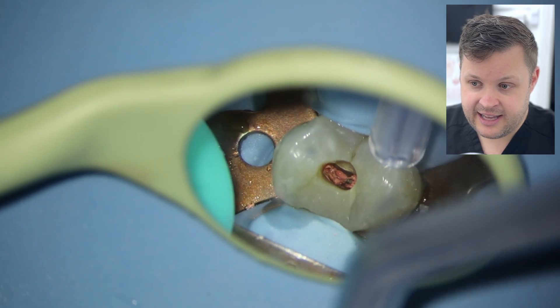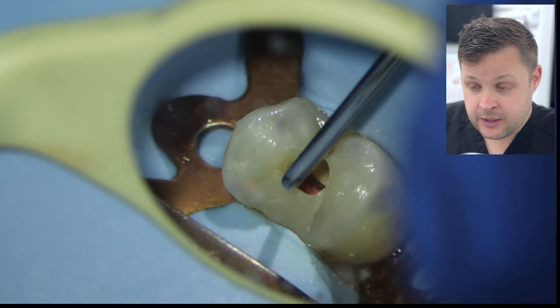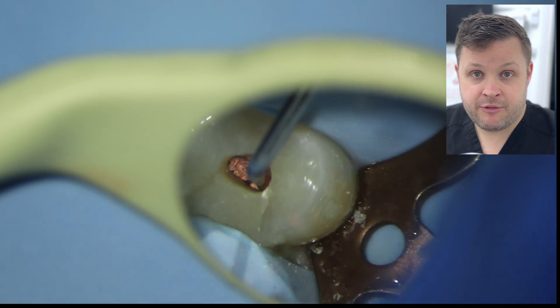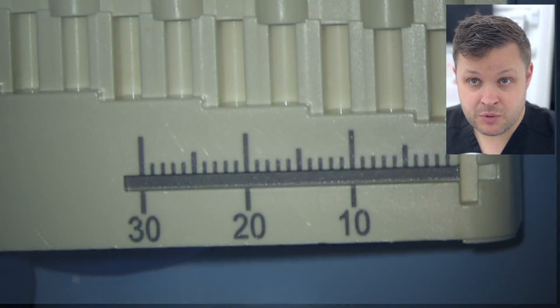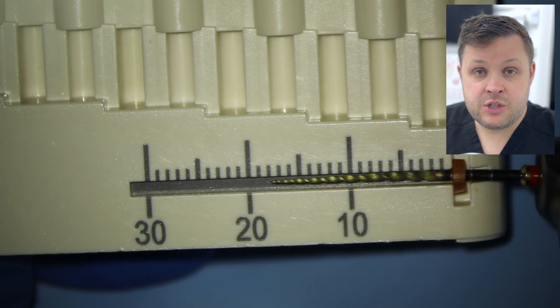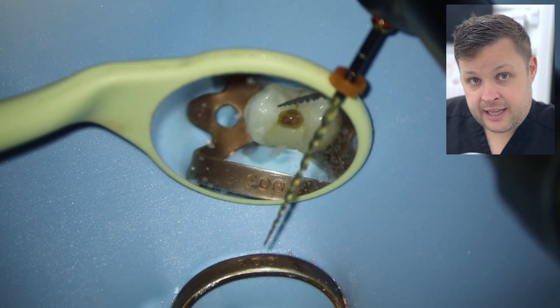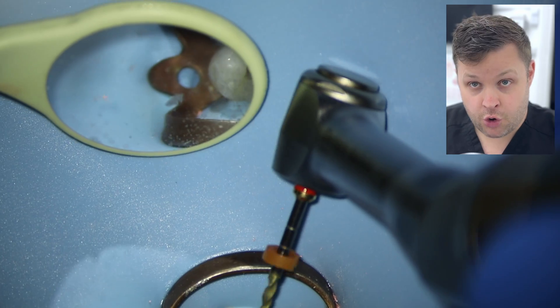I think I can see two distinct GP points, but we'll find out later that they aren't that distinct. I'm using a DG16 endodontic probe, slowly picking away at the GP — I want to lift it away from the wall, because if it's condensed against the wall it's difficult to remove. The CBCT indicates the join is around 18 millimeters, so I'm going to use a size 25 HyFlex variable-taper file to try and remove the GP to 17 millimeters.